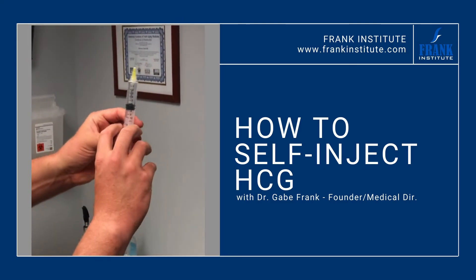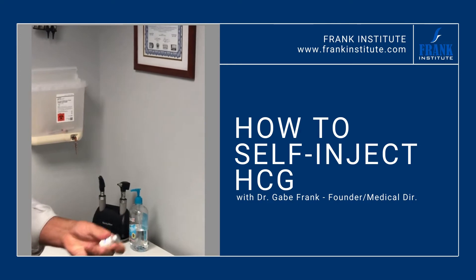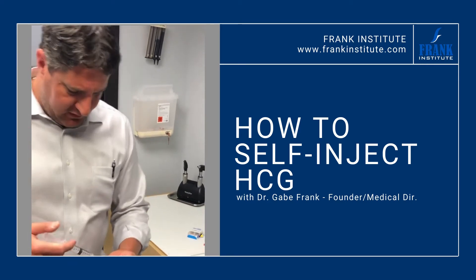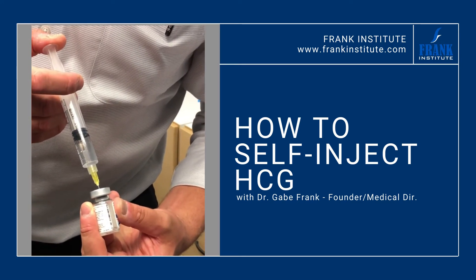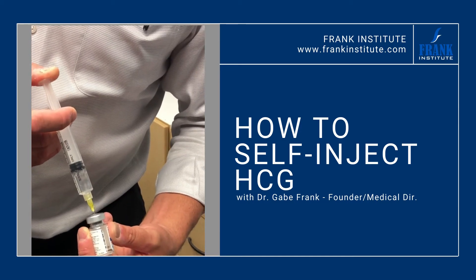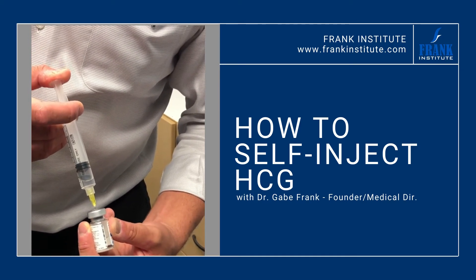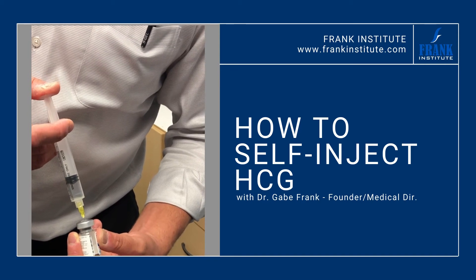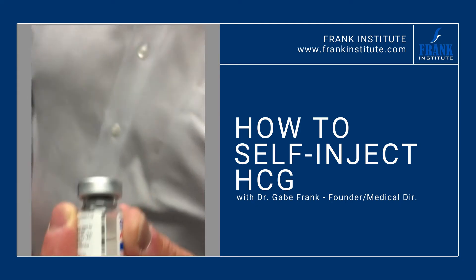So you can see we're actually past the six mls, but we've got a little bit in there. We're going to take our bottle of medication — the powder — and go ahead and inject. You want to go nice and slowly. It will mix as you inject it. Going nice and slow — when you get about halfway in, you start feeling the pressure build a bit, just kind of let go. Air will fill, pressure will go down. You're putting the water in right at the end there, just kind of let up again — less pressure. Go ahead and finish it out, let the rest of that air out. It's pretty much mixed itself.